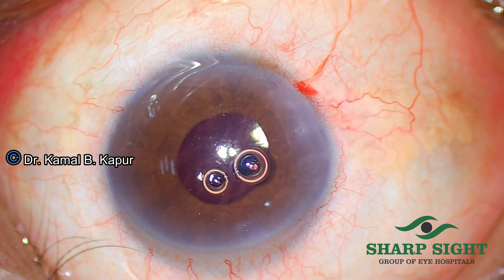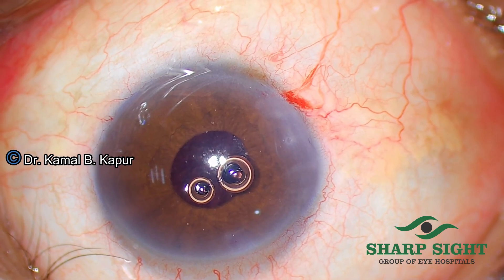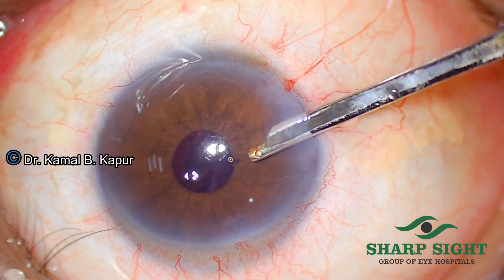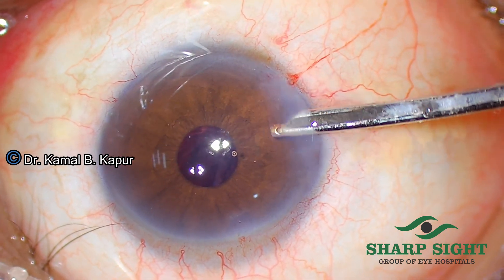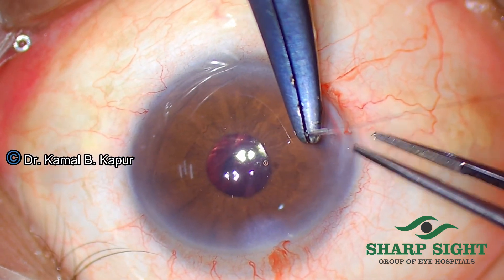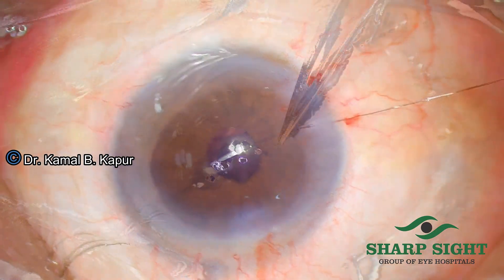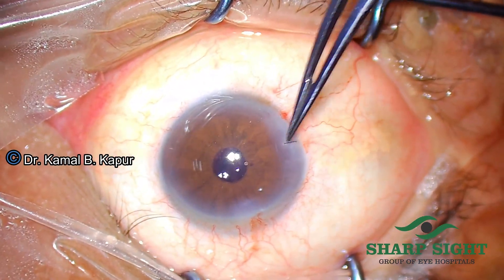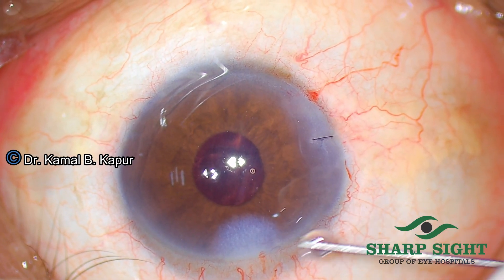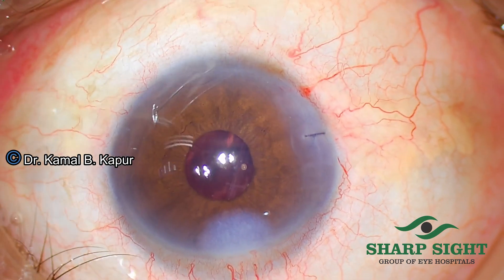Making sure that both haptics have been opened in the sulcus and the IOL is well centered, all we need to do is instill a miotic drop which constricts the pupil on top of the IOL and they just go in. With a Simcoe cannula at a low bottle height of approximately 60 cm, we aspirate any viscoelastic in the anterior chamber. Since we used a very small amount of viscoelastic with a 27 gauge cannula behind the iris, the amount that may have leaked into the vitreous is very minimal, making any inflammatory reaction a very rare incidence. After that we suture the wound and hydrate the side port, and the IOL is beautifully centered with a round pupil.